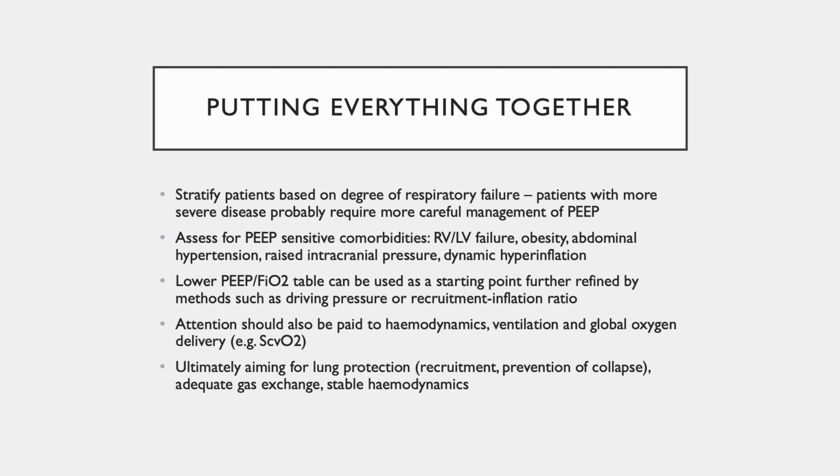And ultimately, aiming for lung protection through recruitment and prevention of alveolar collapse, adequate gas exchange from both an oxygenation and ventilation standpoint, and stable hemodynamics. Hence, it is important to remember that the effects of PEEP are multifactorial, and it is important not to just look at a single parameter, but all these various important endpoints as well.